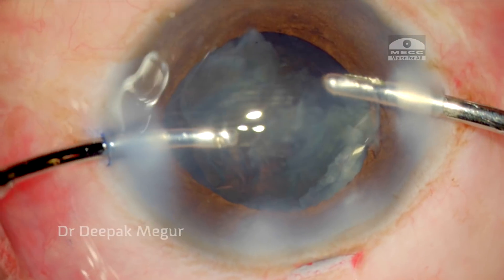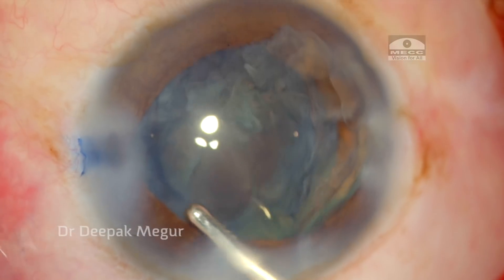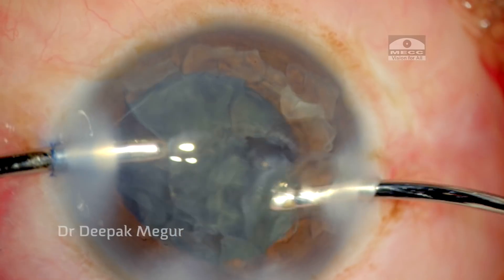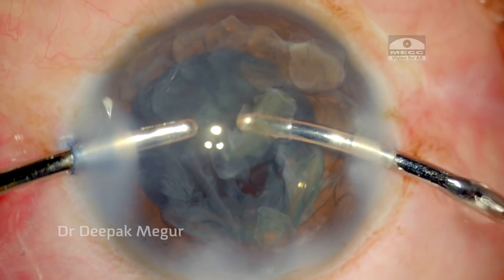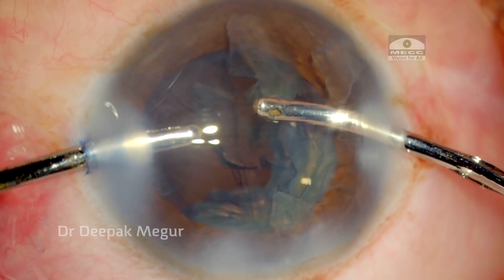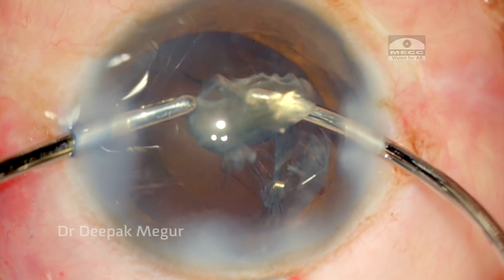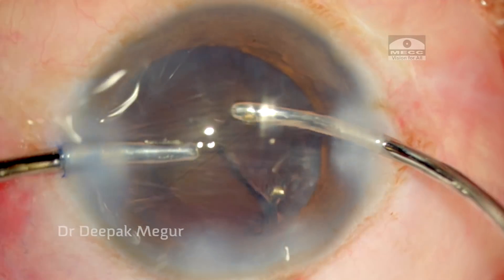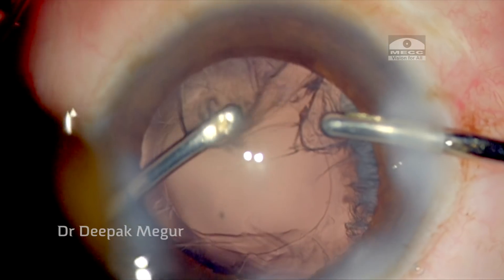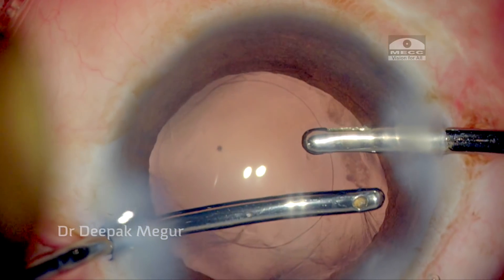I go in with the irrigation handpiece through the main incision to manipulate the entire epinuclear bowl out of the capsular bag. This is a simple trick — sometimes removing the epinucleus can be challenging and frustrating, so using either viscoelastic or fluid to mobilize it out of the bag is helpful. Once it's in the anterior chamber, aspiration is no big deal. We are then left with a small amount of cortex, which is removed using an equatorial stripping technique, taking care not to damage the rhexis.